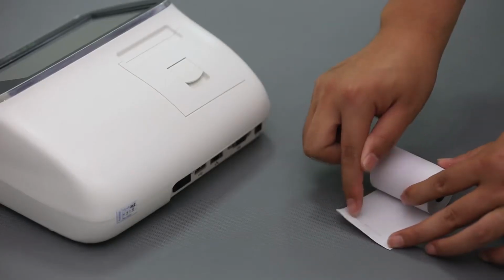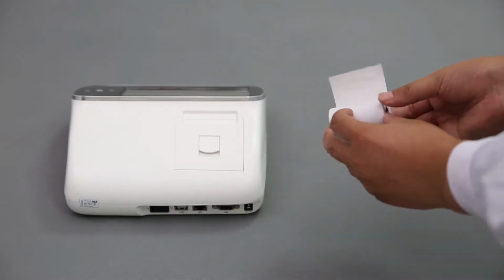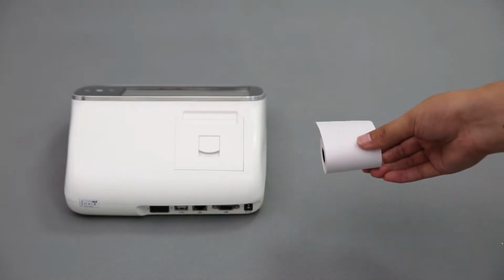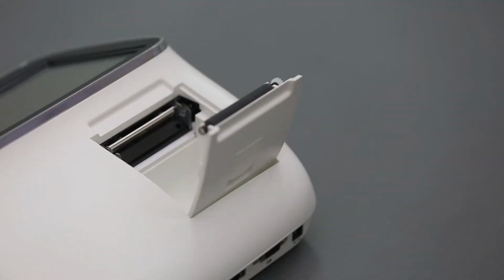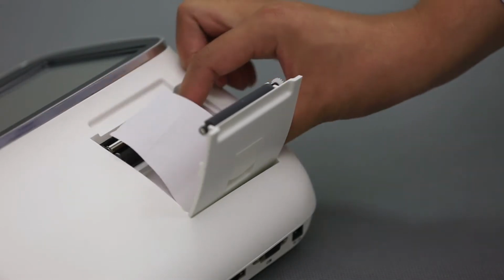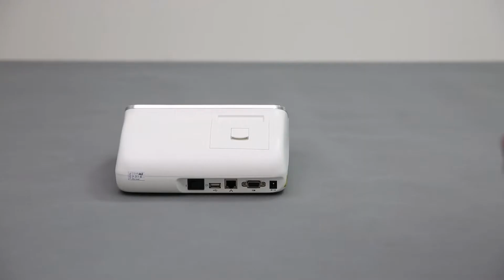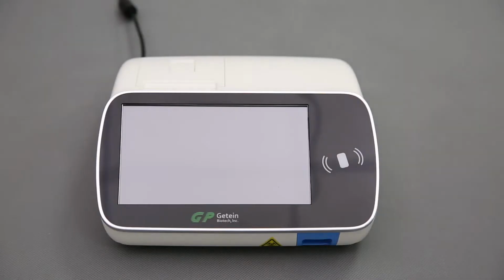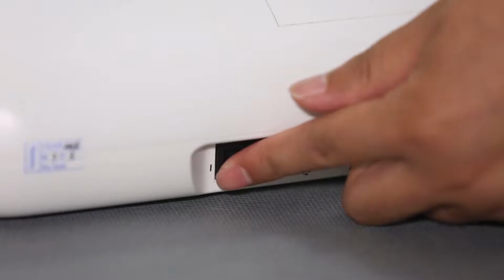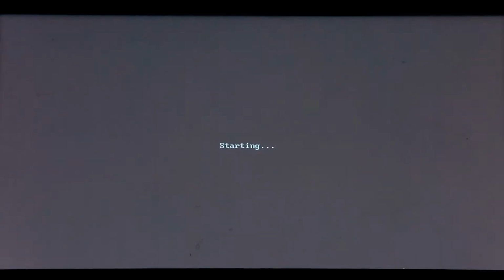When installing the printing paper, draw a line on both sides of the paper and load it into the print port with the side that has a black line facing down. Before turning on the analyzer, connect the power supply and the barcode scanner, which is optional. Press the switch to turn on the analyzer. The system will start its self-checking and then enter the main interface.